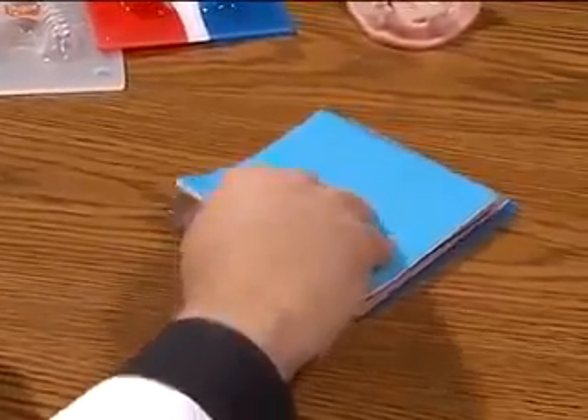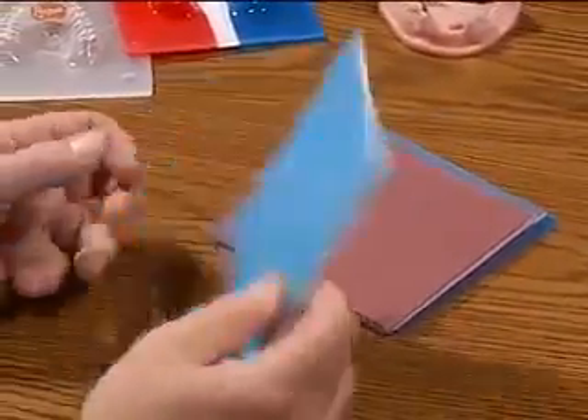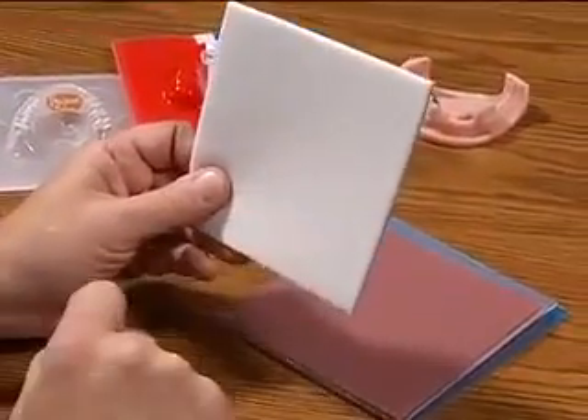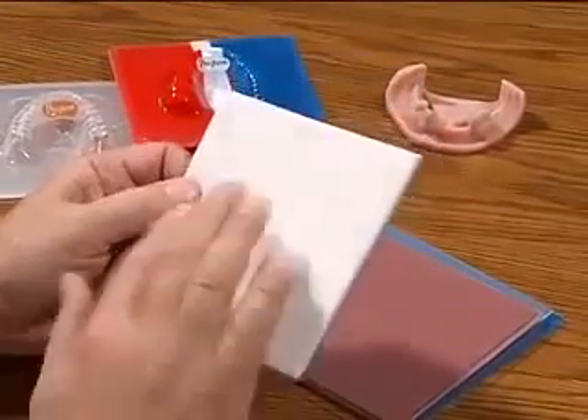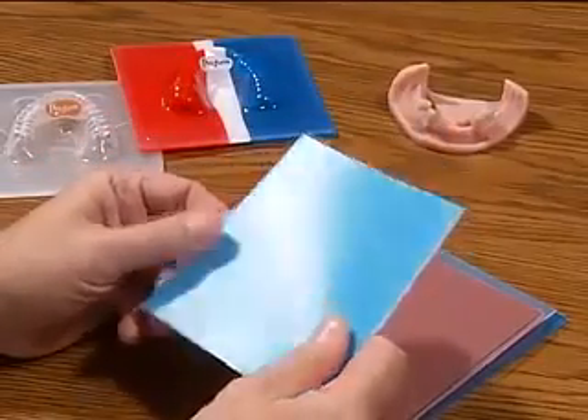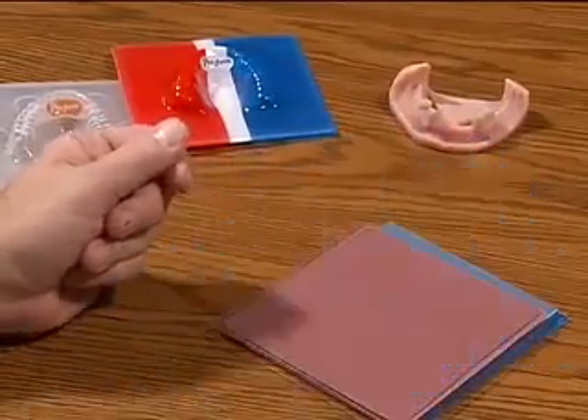Another product which is unique to vacuum forming materials is a bleach tray material, which has a foam inside which holds the bleach material intact when applied to the patient's mouth.